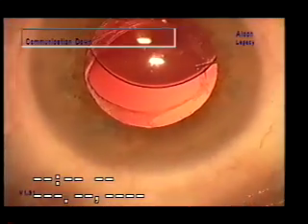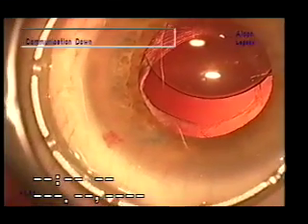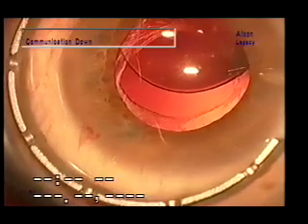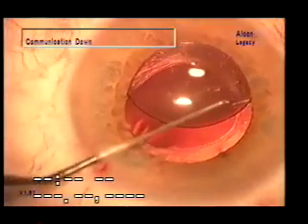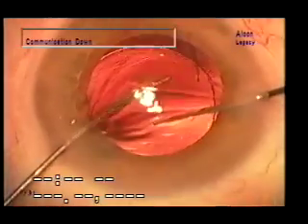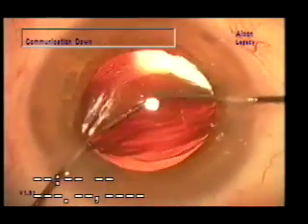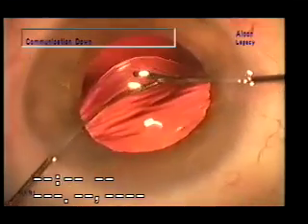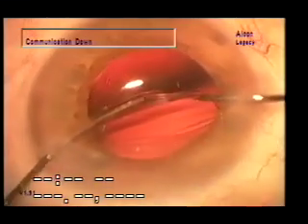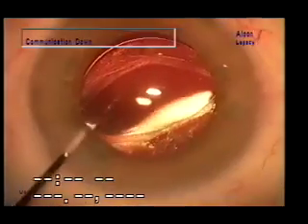We'll now show a surgical example of membrane optic capture used for centration of a sulcus lens that had moved eccentrically because one haptic was in the bag and the other out of the bag. The lens is rotated so that both haptics are in the sulcus, and then the optic is pushed through the opening in the membrane to stabilize the implant. The opening is just a bit marginal here for capture, but these fibrotic openings are very resistant to tearing, and one can use quite a bit of force. The bottom goes through first, then the upper part snaps into place as it slides under the capsule, becoming fixed with optic capture by the membrane.